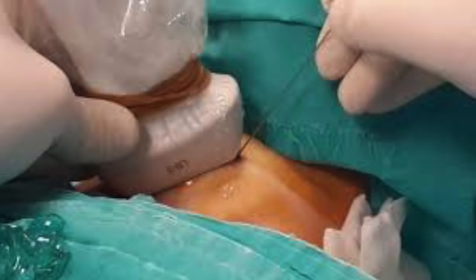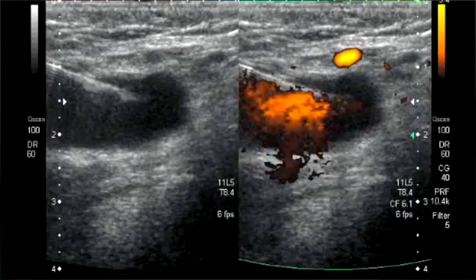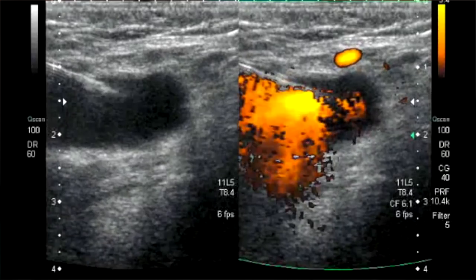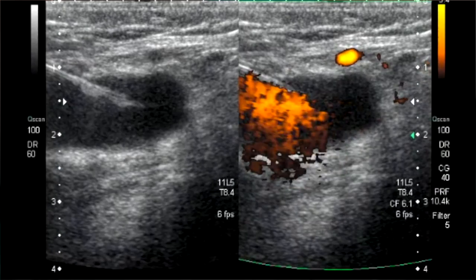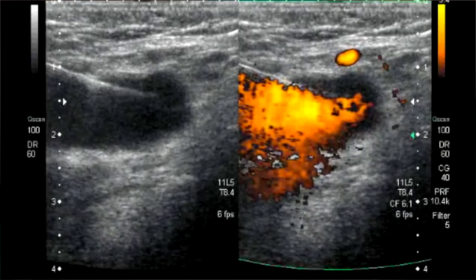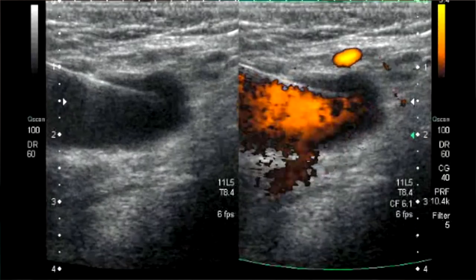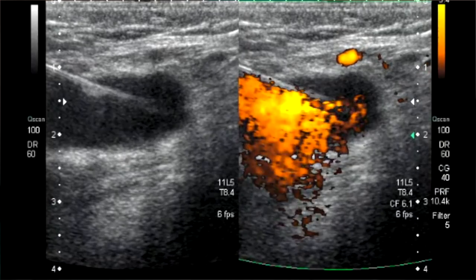For beginners who fail to visualize the needle in part or as a whole, Doppler can help visualize the tip. Many machines have a dual mode where grayscale and Doppler are seen side by side during live scanning. Whenever the needle agitates through tissue it creates a flash of color on Doppler, which can help track the needle and reaffirm its location.